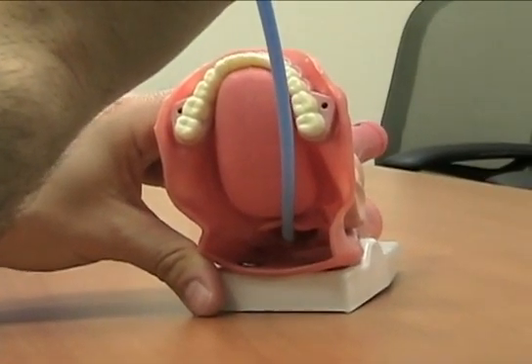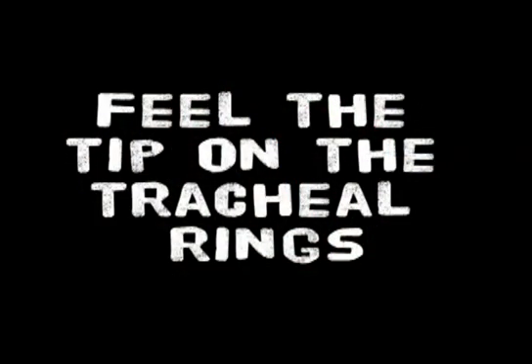And that's the key. Now, how do you know you're in? Well, there are two ways that are described. The first is you can actually feel the tracheal rings — you'll feel the tip of that bougie, that coudé tip, rubbing against the tracheal rings. Sometimes I feel it, sometimes I don't. What I keep doing is pushing the bougie forward very gently, and eventually, if you're in the tracheobronchial tree, you'll get holdup.